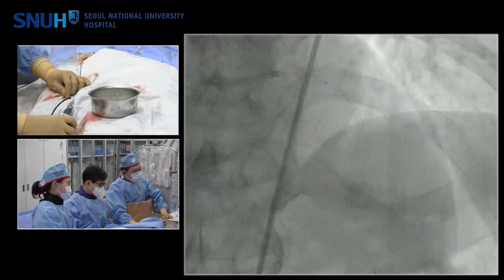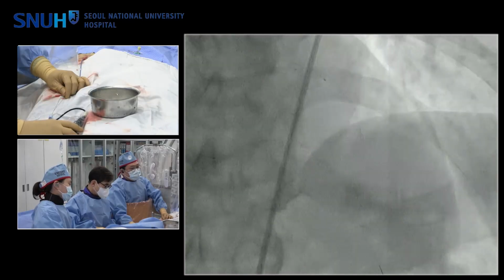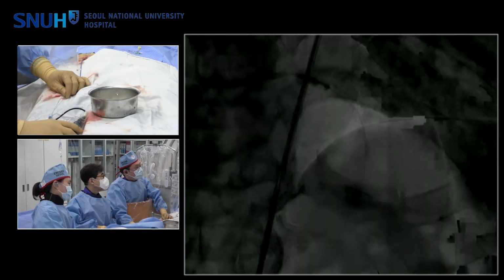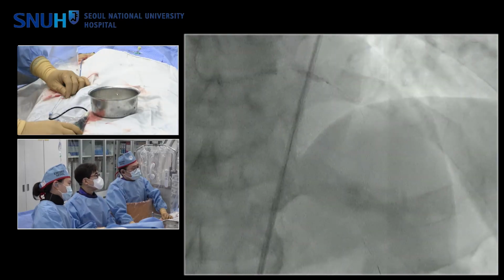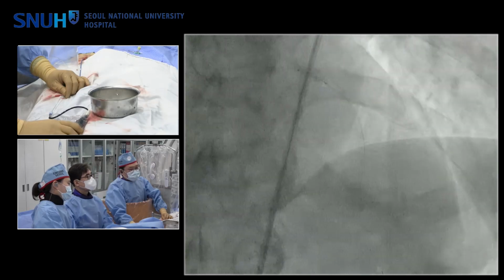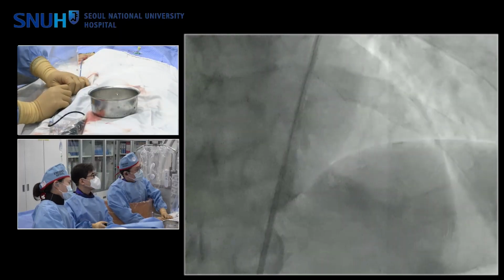Okay. So you may prep the balloon and get rid of all the air, but when you do IVL, it generates air. So often you will have to re-prep the balloon halfway between. It's very important because once you have an air bubble like this, it's less than 50% effective. You really reduce the effectiveness of the IVL when you have an air bubble like this. So at this stage, it's really important to re-prep the balloon to take the air out.